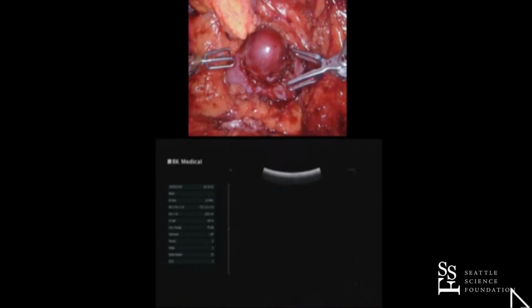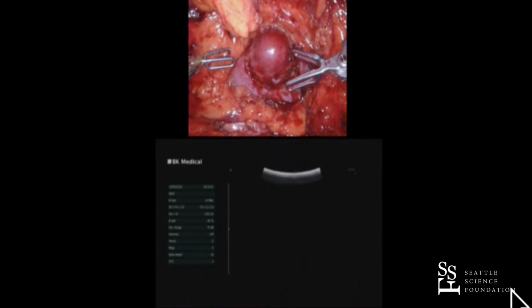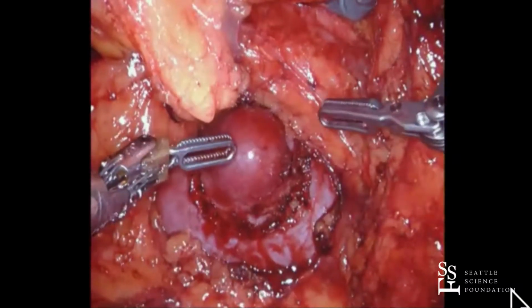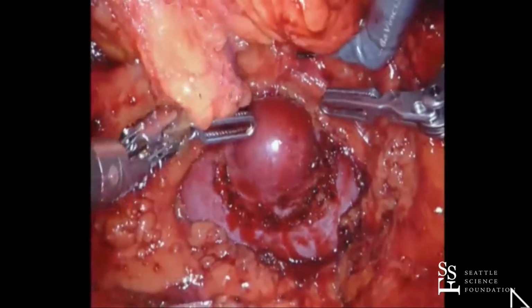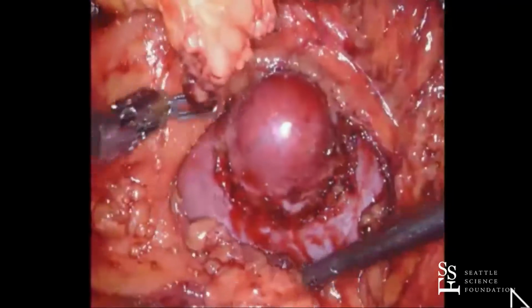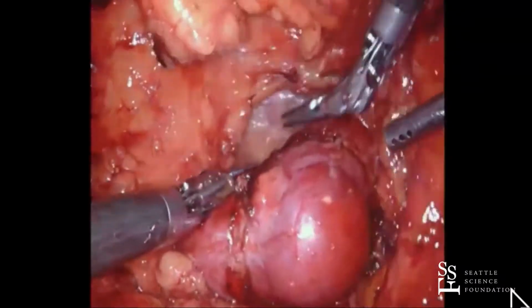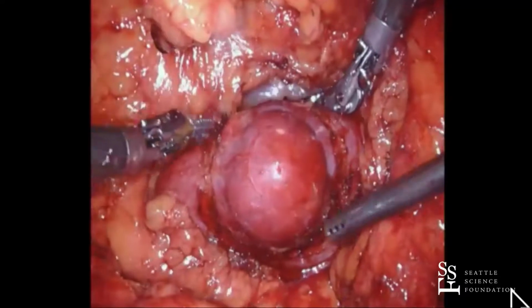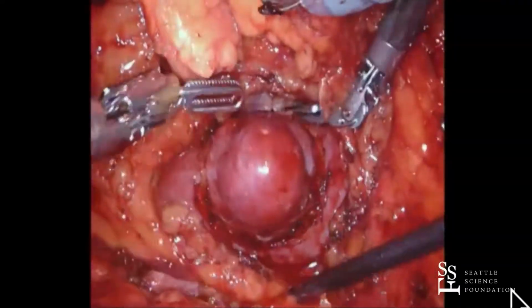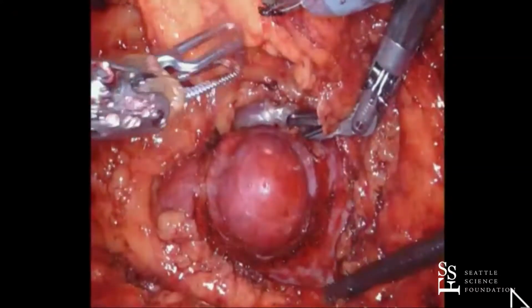That's a nice metric, scissor and a half. Is that the Canadian metric system, scissor and a half? Scissor and a half, yeah, it's Canadian. We're very close to Canada here. But I think that's kind of where we are. Most cortices are about 2 centimeters. Hot shears are a centimeter, the metal portion's a centimeter, so a centimeter and a half is about 15 millimeters.